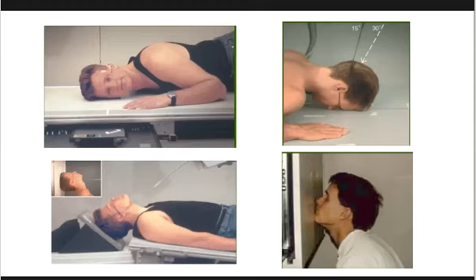Always remember, when we x-ray the sinuses, the patient is always in an upright position. Why upright? Because there may be an air level or fluid level or other pathologic conditions affecting the accessory nasal cavities that can be demonstrated. Always upright.